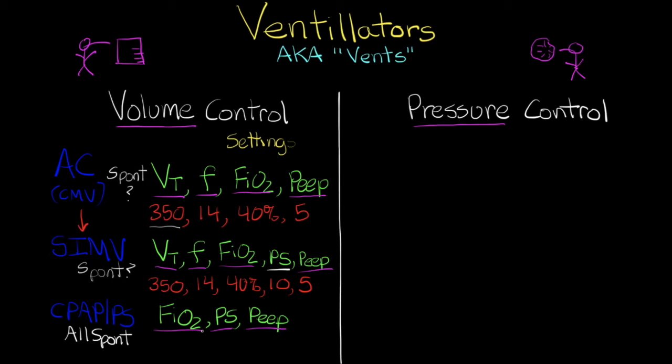So know that just because you're putting them on CPAP doesn't mean that if they aren't breathing they're not going to get support from the ventilator. And if that does happen, then a lot of times we make sure the patient is awake, reset the alarm, put them back into CPAP, and let them try again. If they still are doing the same thing, then we may just go back to a rate and give them some time until they're a little more awake, and we can put them back into CPAP and try again.